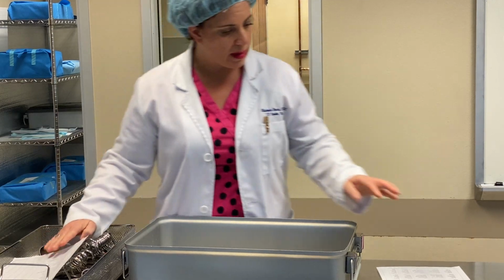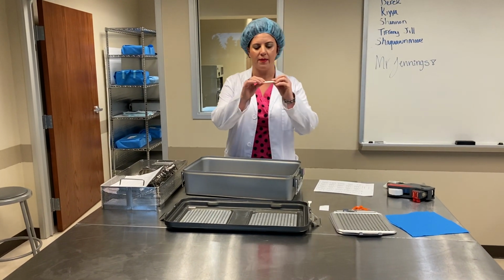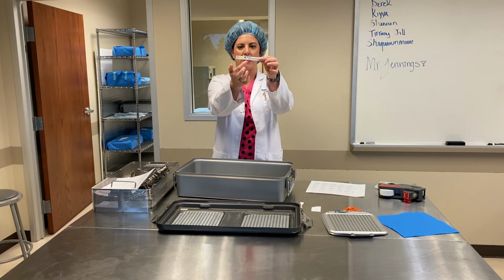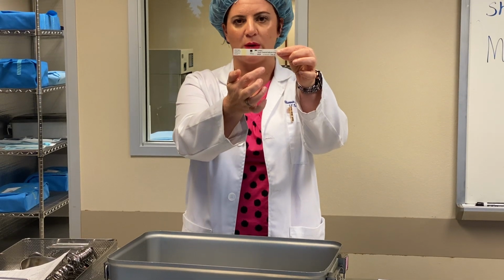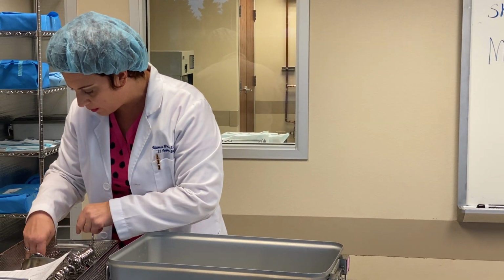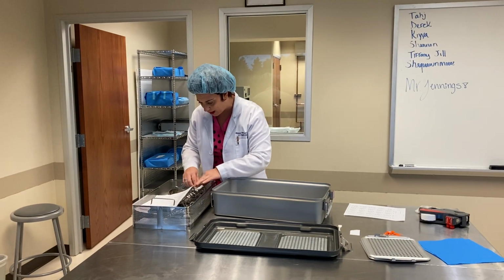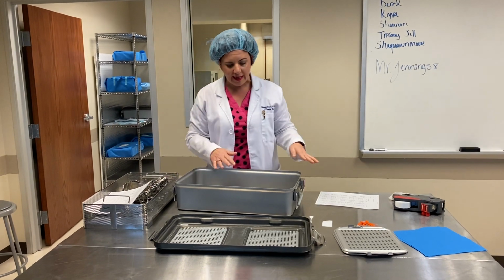We always want to remember to put a sterile indicator into the tray that we have prepped. Remember this steam integrator, the chemical integrator that we talked about before. We're going to put that in there. We want to put that face up where it can be seen when the lid comes off. I'm going to make sure everything's kind of low profile here, and we're going to get our pan.